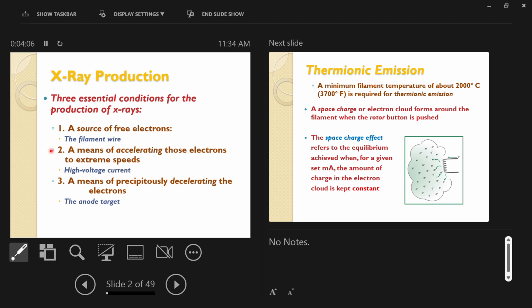With the electron accelerating, you now have a massive object moving at some velocity, some speed, okay? A car sitting still has a mass, therefore some energy, but the car has a lot more energy if it's speeding down the freeway, right? It hurts a lot more to get hit by a car at 60 miles an hour than 6 miles an hour, right? So the velocity that matter travels at affects its energy. Specifically, it affects its kinetic energy, the energy of motion. Electrons moving fast have more energy to give up than electrons moving slowly. We want to make them move fast.